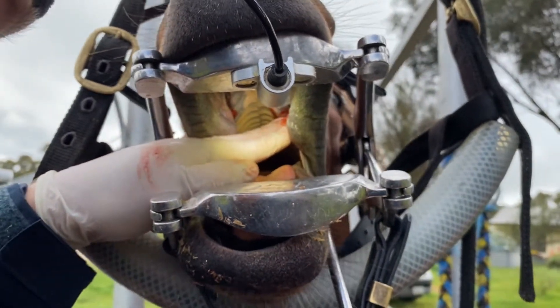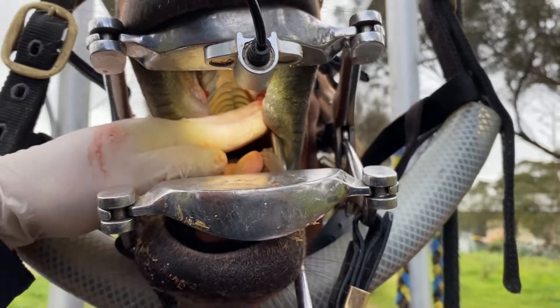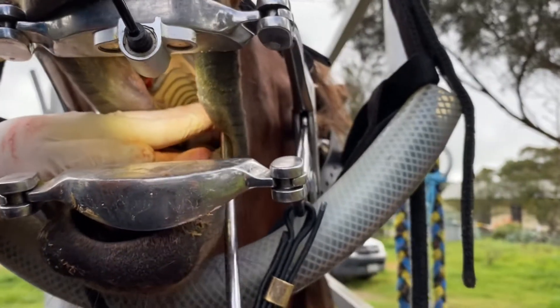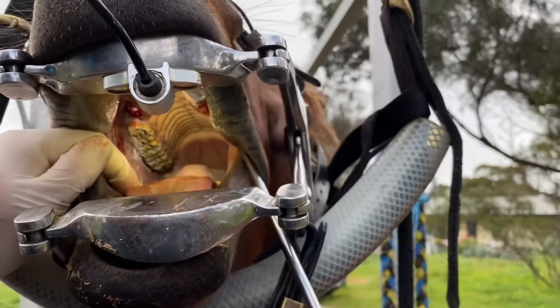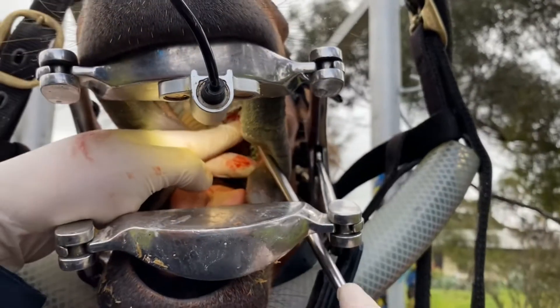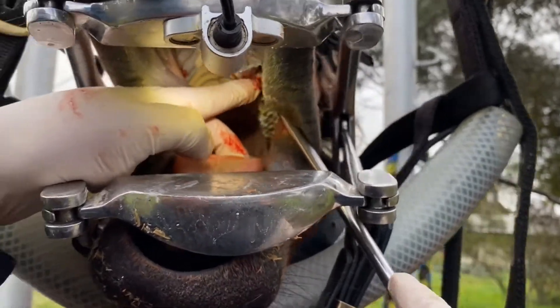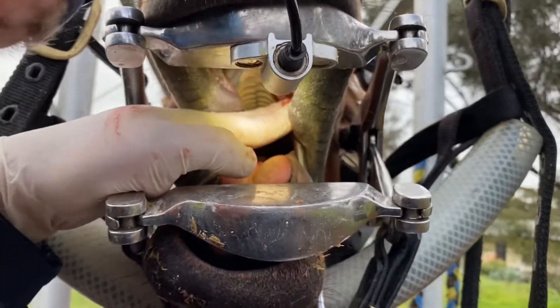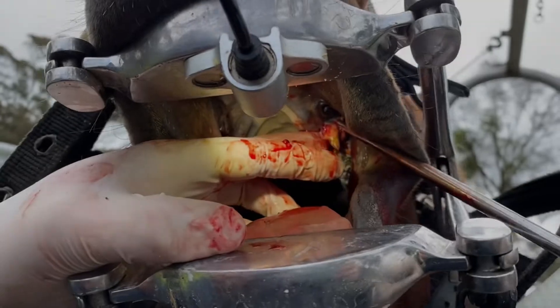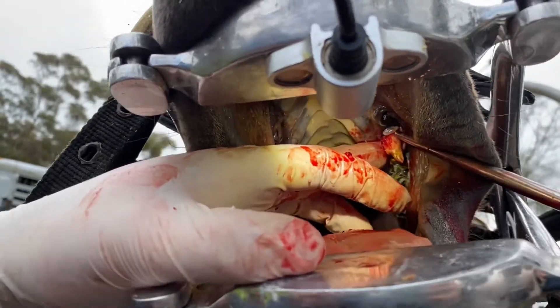Hopefully we minimise any ridden, bit, or learned behaviours in that breaking-in process. We want that to go as smooth and pain-free as possible, and getting all his teeth floated up will really help with that. We'll give him some pain relief after this and also get him a tetanus shot just to make sure he's up to date. They can take a while, these fellas. Got it.